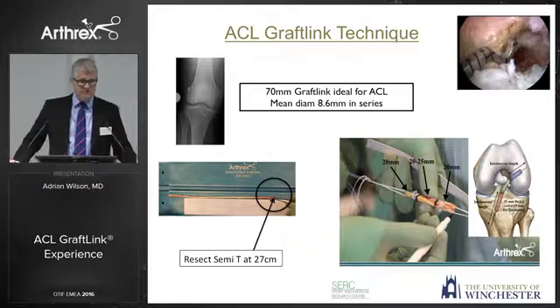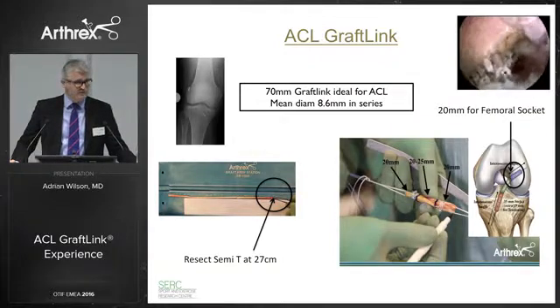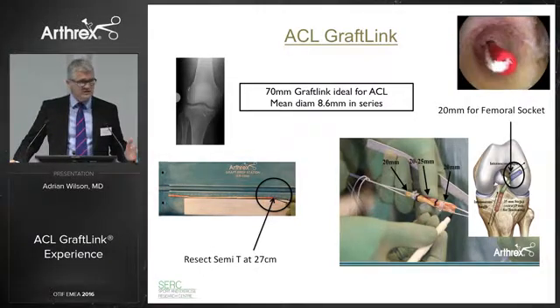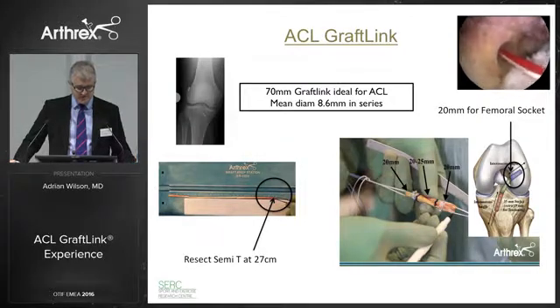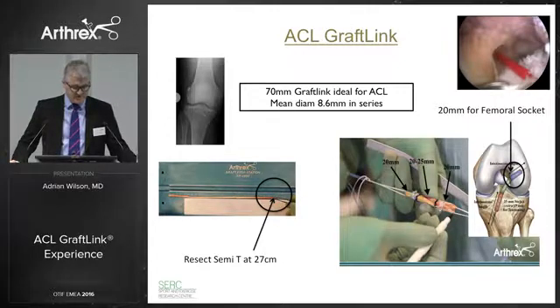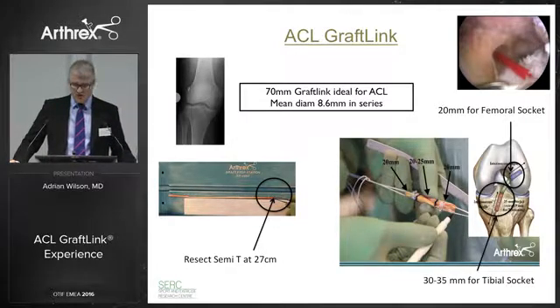So what about the technique? We find 70 millimeters the ideal graft length. So we resect the semi-T at 27 centimeters. When we quadruple it, it gives us a 70 millimeter graft. Then we do some very, very simple steps within the procedure so that we don't have to do any calculating. We make a 20 millimeter socket on the femur every time, for every single case. This socket is made to a depth of 20 millimeters, and a fiber stick or tiger stick is passed. We then make the tunnel 30 to 35 millimeters on the tibia, and that gives us our tensioning side of the equation. So we never have to worry about running out of graft.